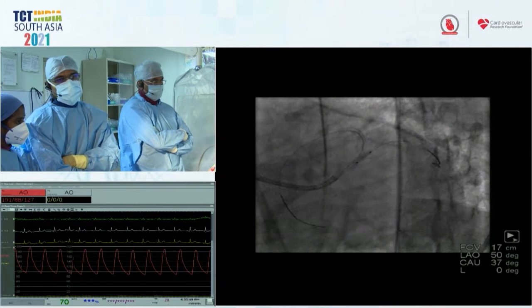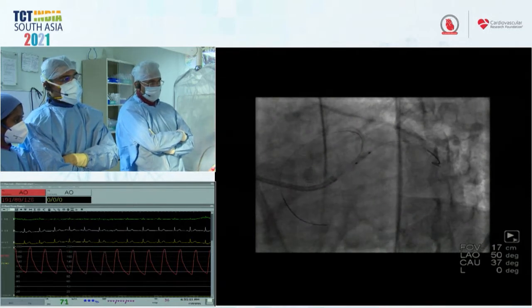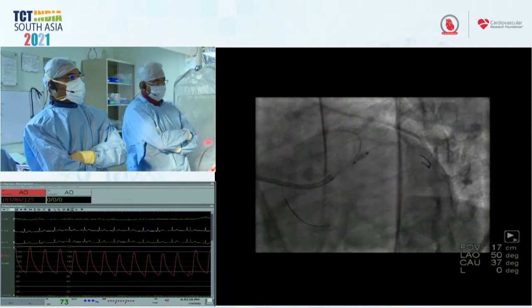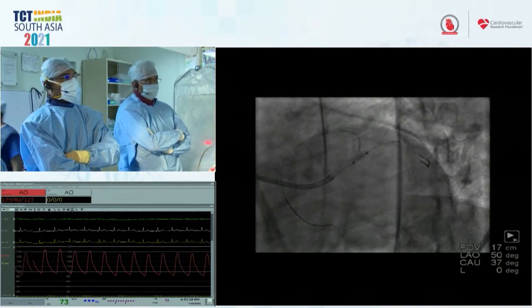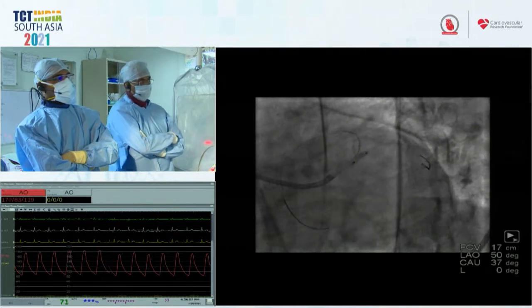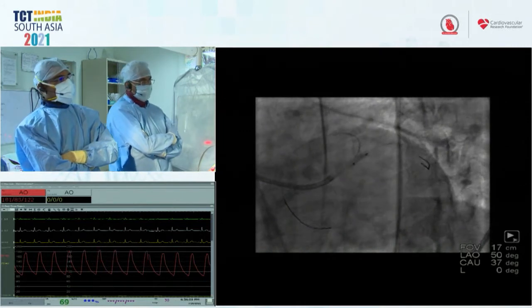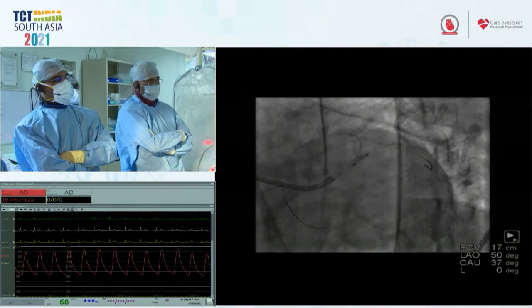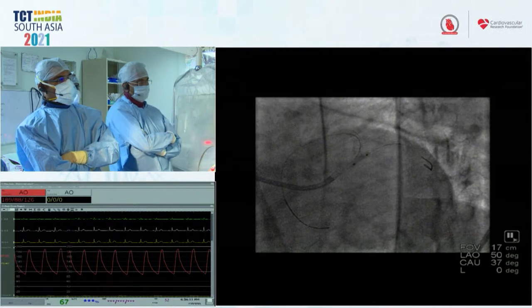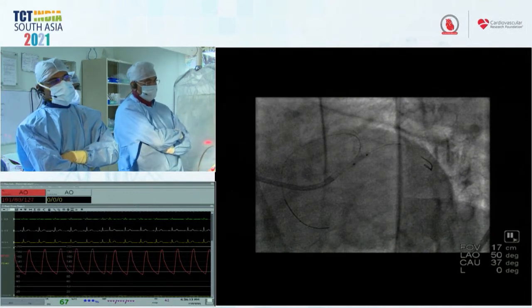So Ajit, let me ask Kevin and Dr. Mustafa here. You've got probably about a 15 millimeter long left main, and you've got a stent protruding from the LAD into the distal left main. Are you double jailing the circumflex here, or are you connecting the dots in the very distal left main with a 12 millimeter stent? Kevin, what's your strategy?